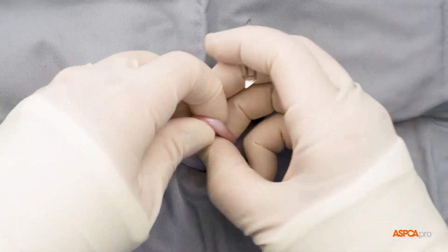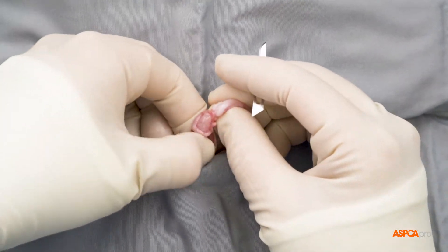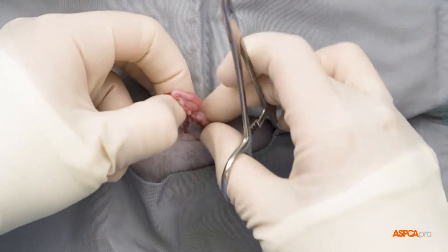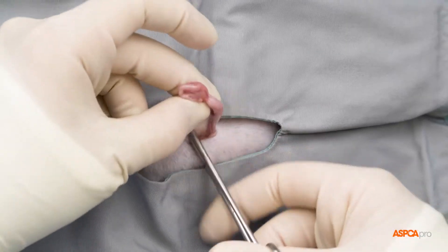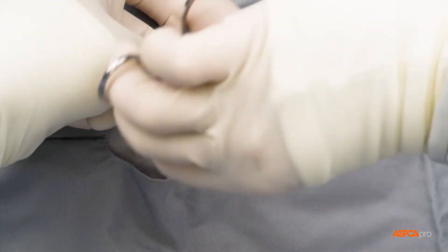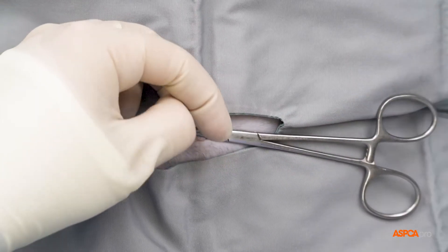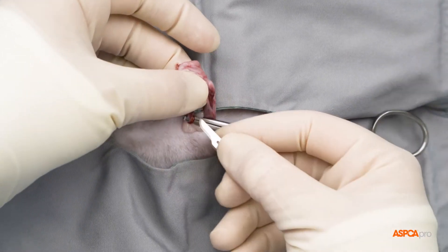Next, to gain better access to the ovary, the suspensory ligament is severed, and a window is made in the broad ligament. The pedicle is now auto-ligated, meaning tied on itself in a knot. There may be an increased heart rate at this time due to surgical stimulation. The ovary is now cut away.